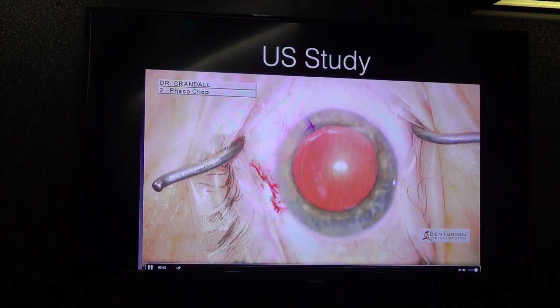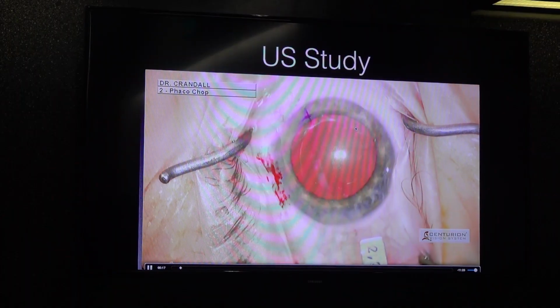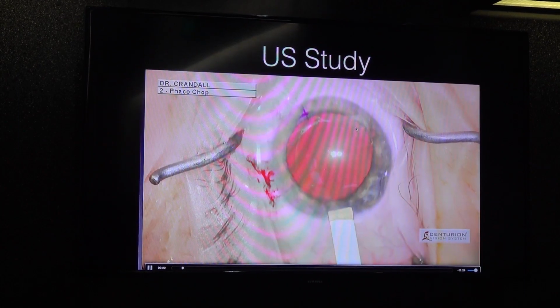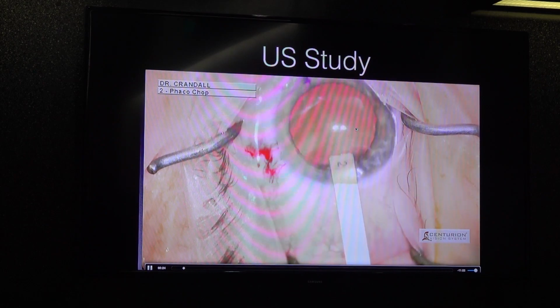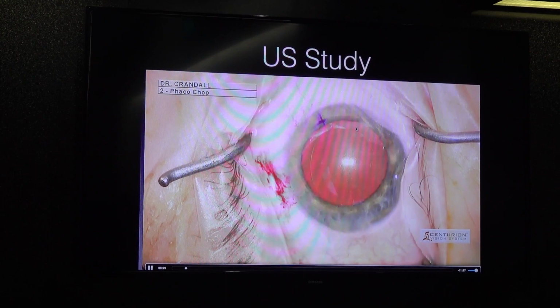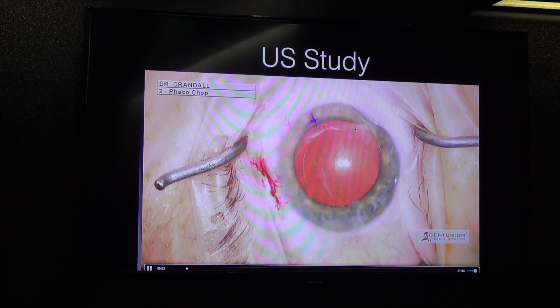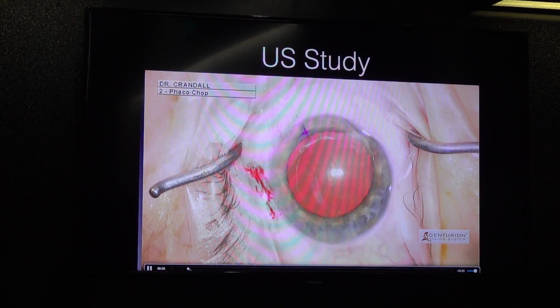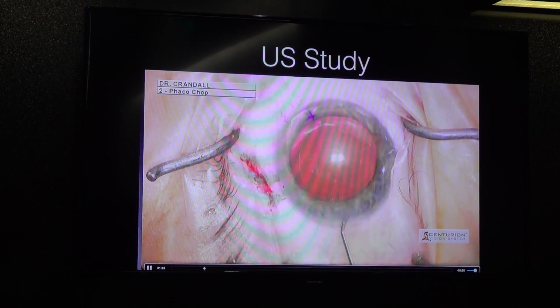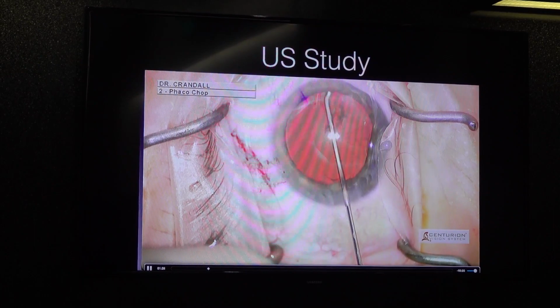It's got a marker, which you can see here for the cornea, and then instead of putting it back and handing it, and since we're doing a study, we're measuring. These are going to be 2.2s for my studies, so that we can make sure that we're getting no outflow. And then you'll see here, let's speed this up, the pre-chopper comes in measuring different lengths. And that's the new hydrodissection piece.